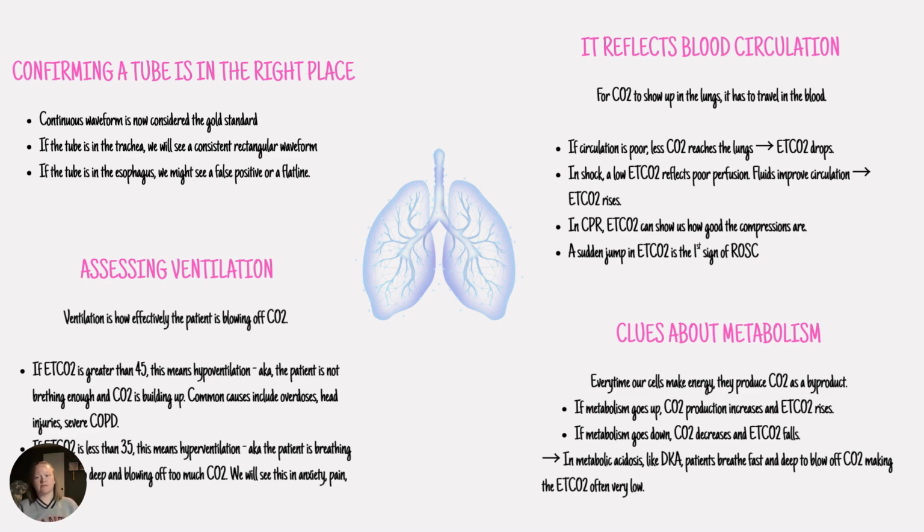And clues about metabolism. Every time our cells make energy, they produce CO2 as a byproduct, like I mentioned before. So if metabolism goes up, like in a fever or seizures, CO2 production increases and that end tidal rises. If metabolism goes down, like in hypothermia or cardiac arrest, CO2 production decreases and that end tidal will fall.